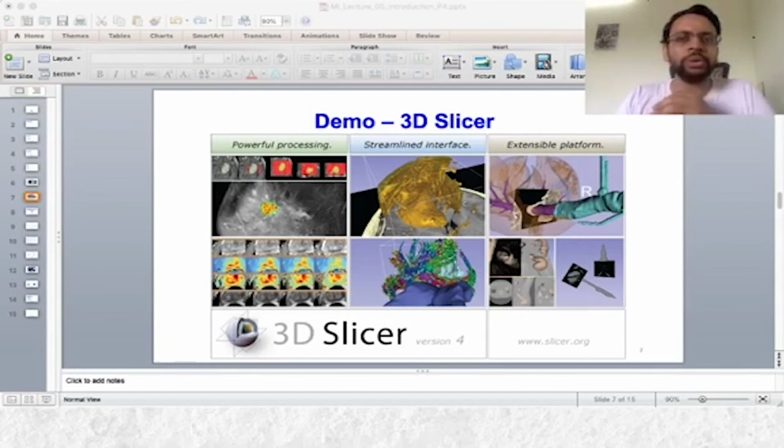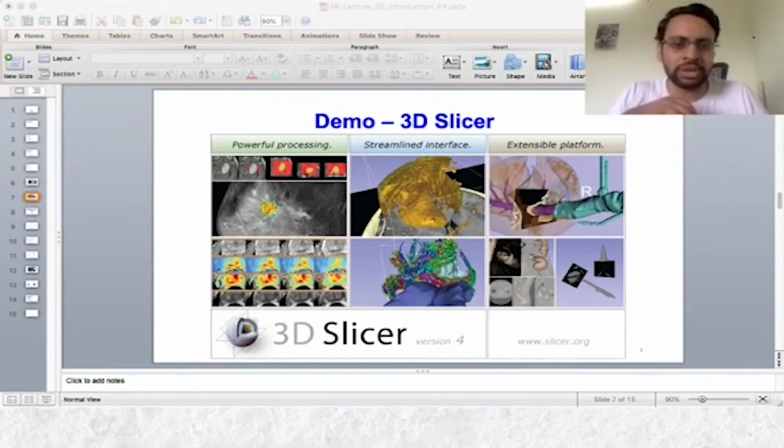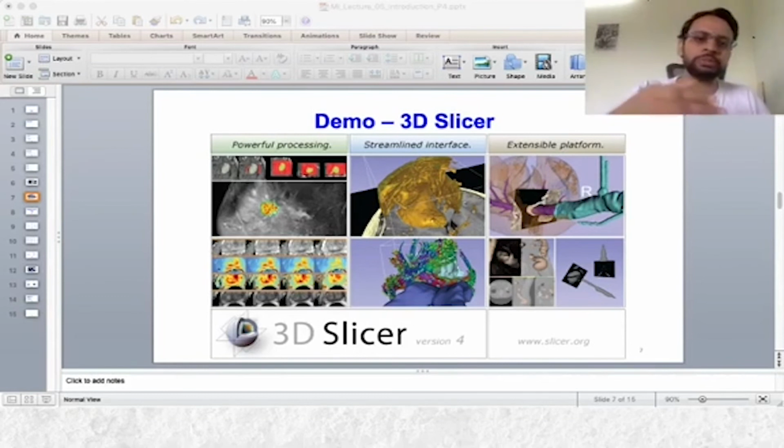Let's say you want to build a template that you could use to compare with the functional MR imaging of another subject and see where you could see a significant difference in the functional response. So this allows you, for example, to make a normalization from multiple images, create a normalized image, compare it with a new image, and then say that the response in so and so regions is statistically significantly different from the normal image, and so on. This is like a toolbox built on top of MATLAB.